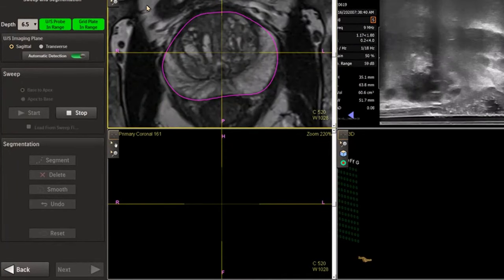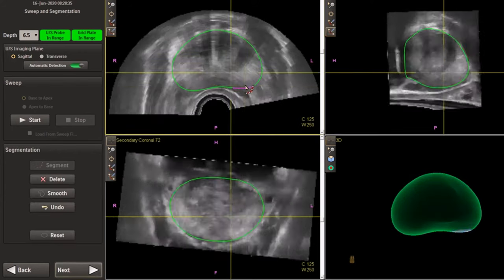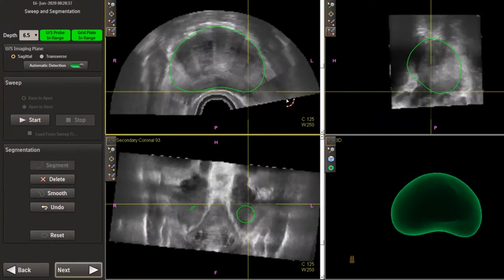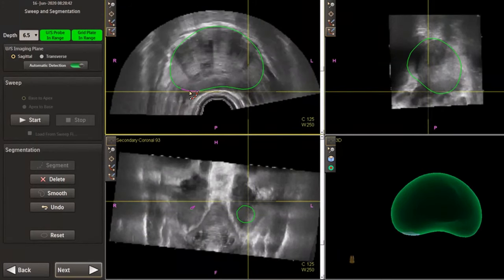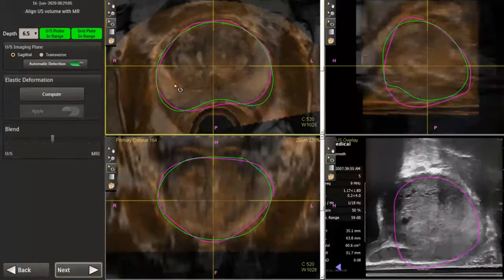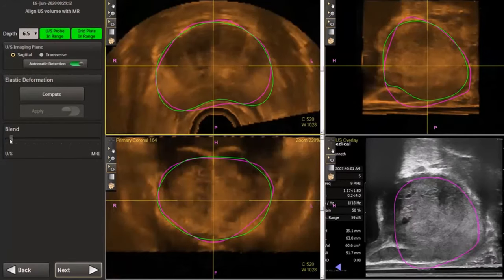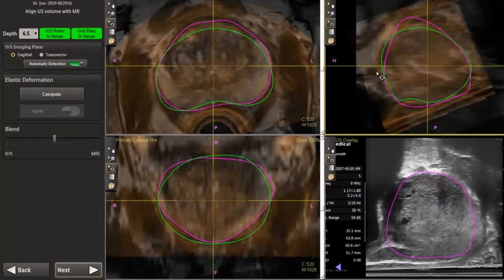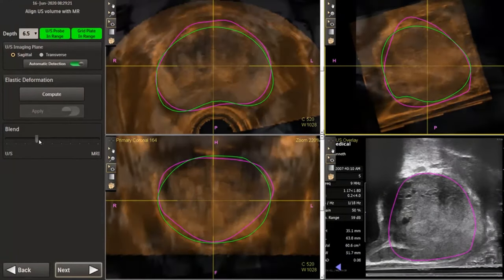Proper prostate segmentation is crucial to ensuring that the live ultrasound image correlates well with the uploaded MRI images. This begins with a smooth and uniform speed sweep of the prostate. The borders of the prostate are selected and the edges are properly chosen in the axial and sagittal views. Segmentation should be performed as the prostate is scrolled through in each view. Blending should be performed between the ultrasound and MRI images to ensure that the bladder aligns well with the prostate in both images. The prostate can be dragged and rotated to better align the images. The green prostate outline from the ultrasound image should correlate well with the pink prostate outline from the MRI image before proceeding.